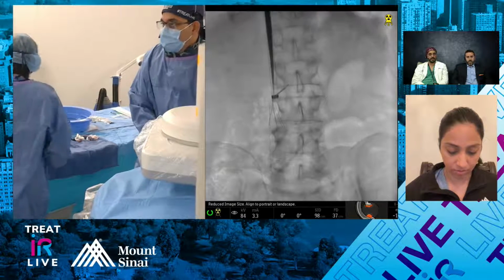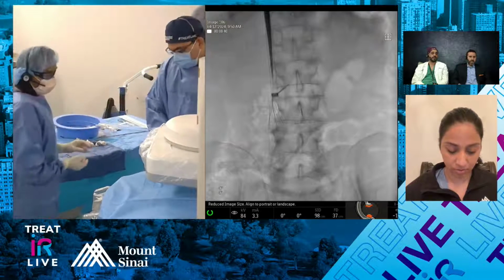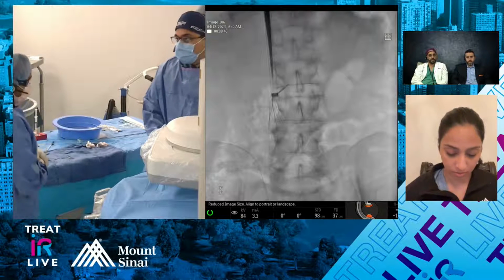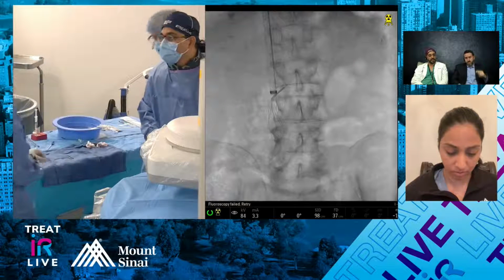All right. Nice. So it looks like they're making their way down. This is the 1840 Cook. One thing we didn't talk about: Raj, did you hold the anticoagulation for this patient, or did you just keep it going? Because now we're going to more rip this filter out.